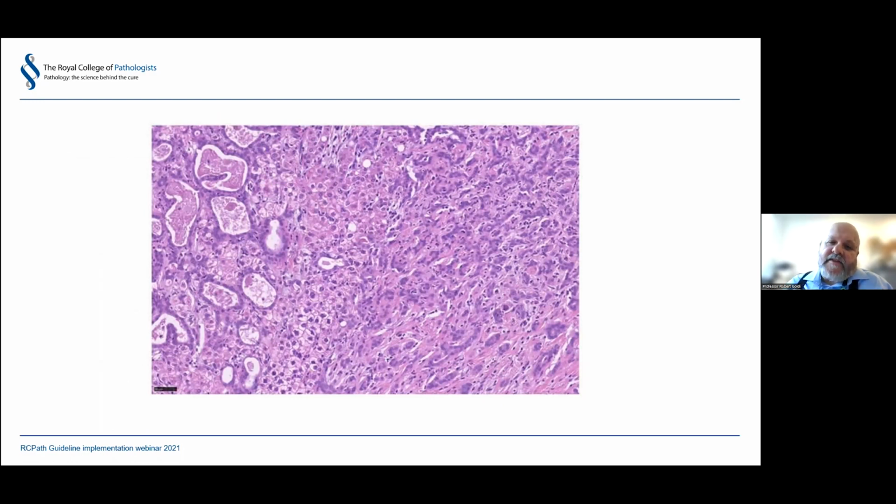I think the other practical point is, if you have a tumor, I personally now tend to take a few extra blocks, because even tumors which are predominantly one may have components of the other. So this is important to be aware of. It can be underdiagnosed, but can very, very easily be overdiagnosed. So I reinforce: it is on the H&E.